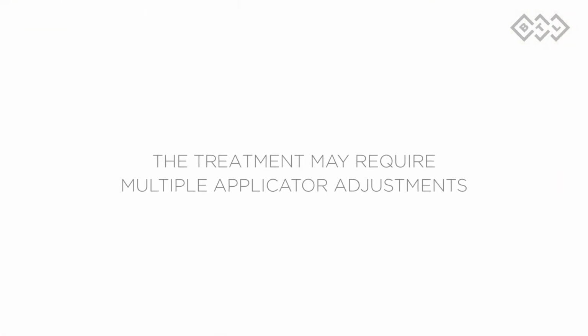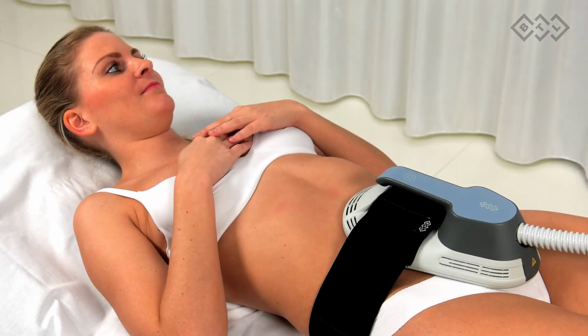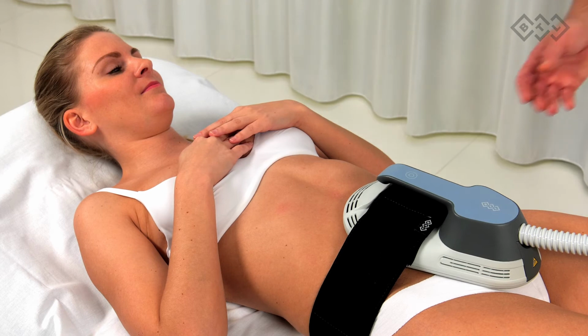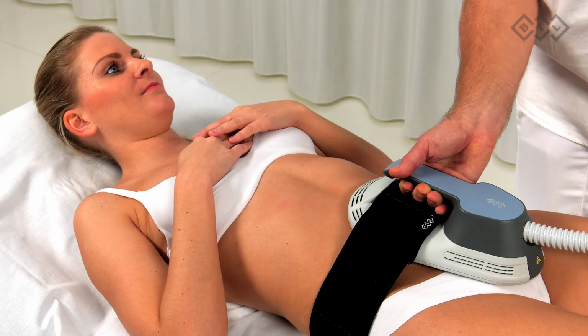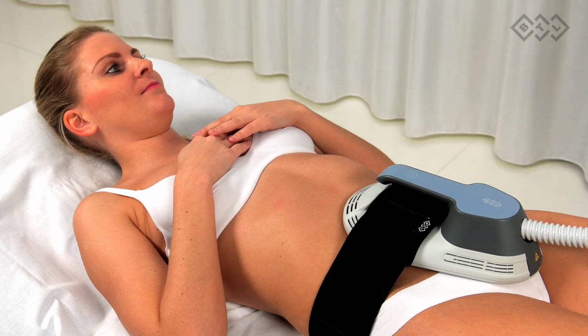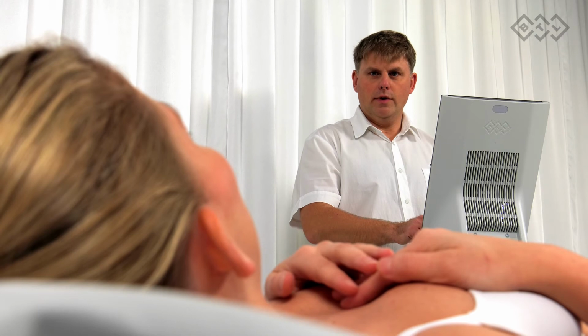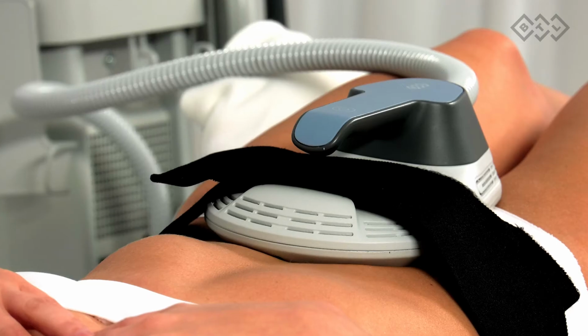The treatment may require multiple applicator adjustments. Make sure that the applicator stays centered over the treatment area for the entire time. It is essential to make adjustments during the treatment if necessary to maximize the efficacy. Continue to increase the intensity during treatment, if tolerated well by the patient.